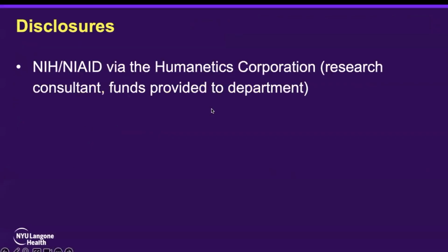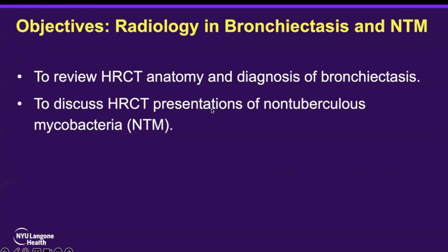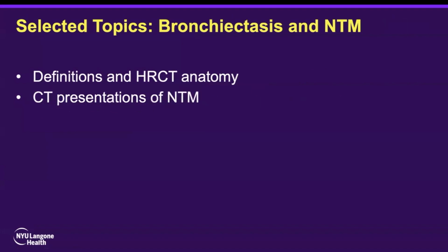First, my disclosures, and on to our objectives, which are to review high-resolution CT anatomy, and we'll cover imaging of bronchiectasis. We'll discuss some HRCT presentations of nontuberculous mycobacteria, and hopefully this will be useful in clinical practice. So let's first begin with definitions in HRCT anatomy.